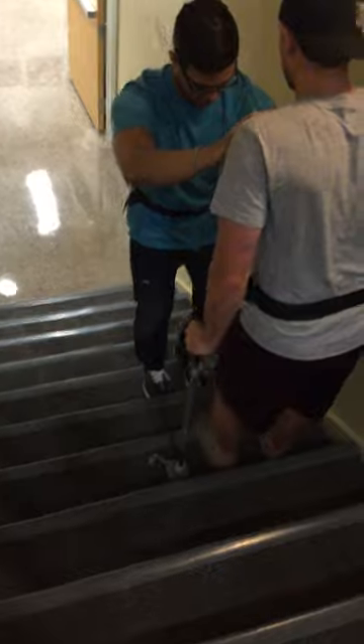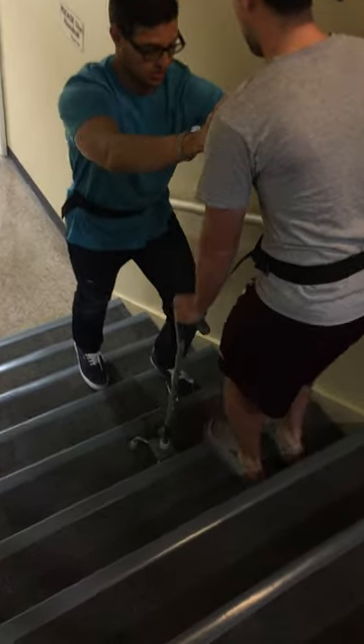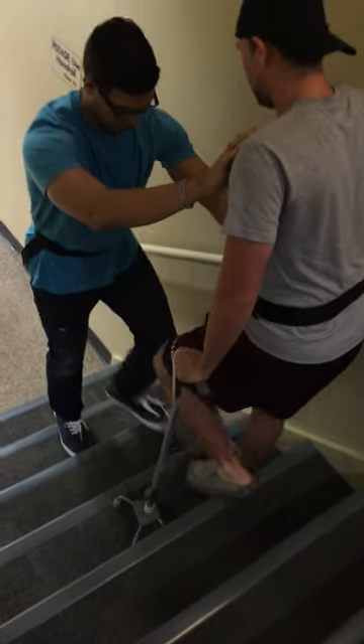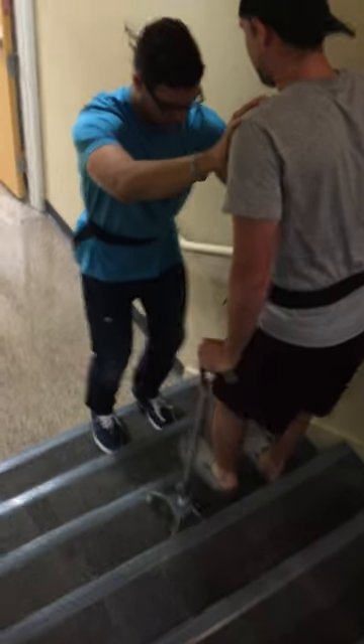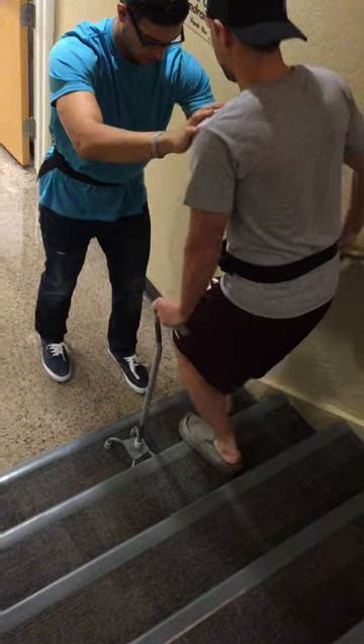We're good here. We're going to go left — right — and bring the cane up. Over there. Right. A couple more steps here. Left. Right.